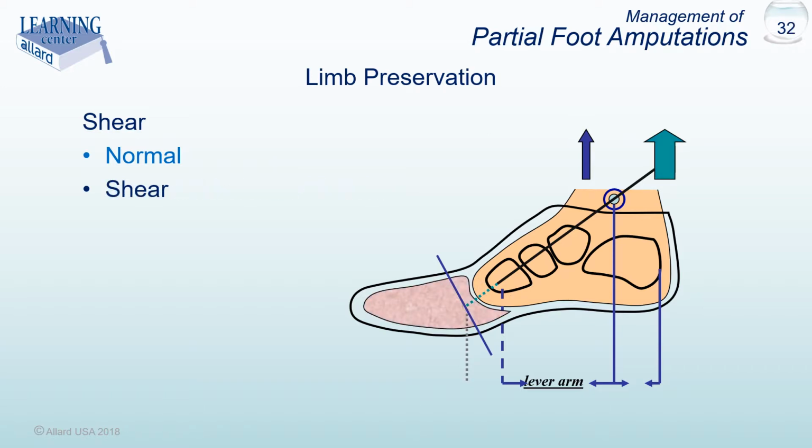Filler prostheses are commonly used in the management of partial foot amputations. While appropriate and necessary to fill in the shoe, they do not function to minimize shearing forces. If a filler prosthesis is all that is used, the foot is at risk for further breakdown.